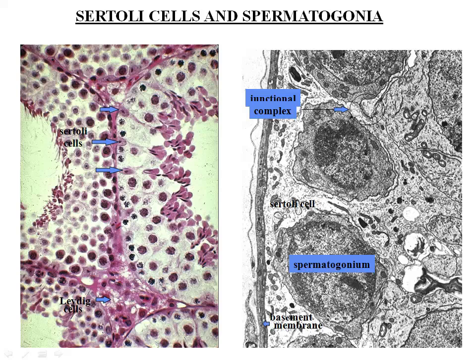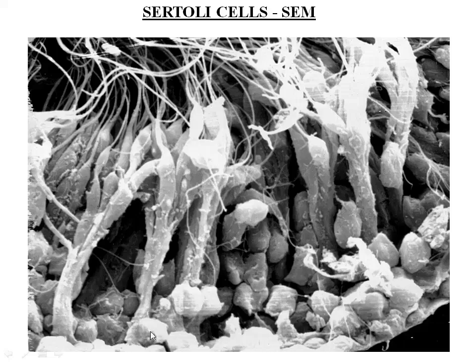These crystals are not stained with the common histological stain, but they can be recognized as a negative image in stained preparations. Now here, in this very close magnified view of this electron micrograph, we are trying to see a Sertoli cell. If you carefully observe the tail of the sperm, the body is attached to some stalk-like structure. All these sperms are attached on this stalk. These stalks are the Sertoli cells.